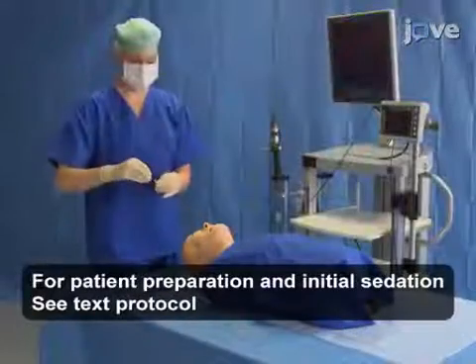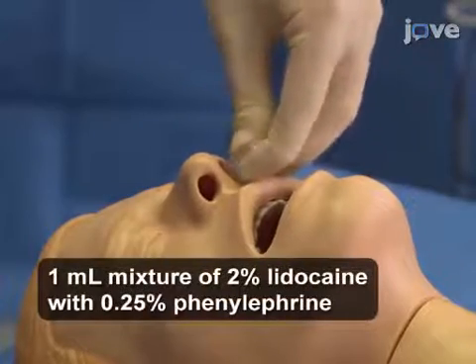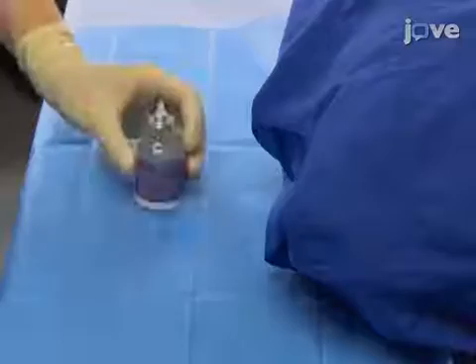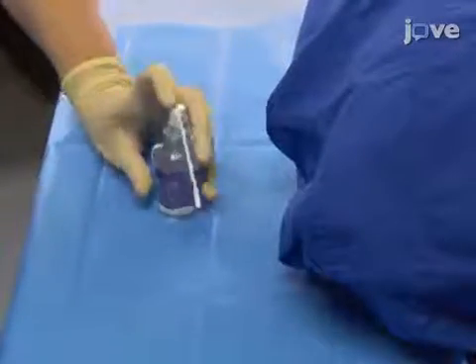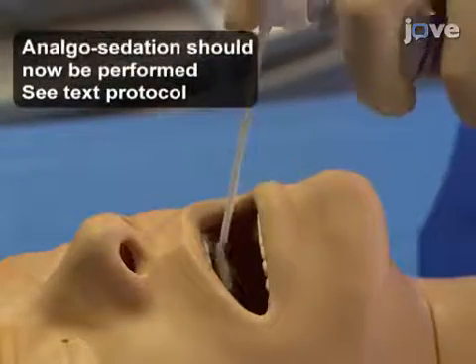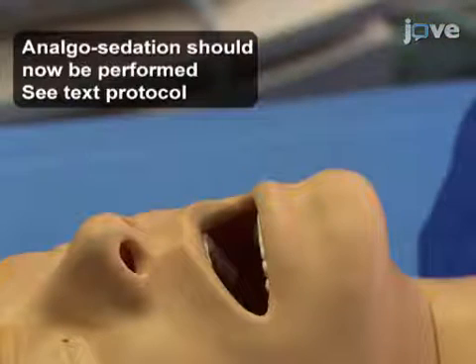To begin, apply a 1 mL mixture of 2% lidocaine with 0.25% phenylephrine to each nostril. Then apply a local anesthetic such as by spraying 10% lidocaine directly onto the mucosa of the oropharynx twice, from the tip to the back of the tongue. Ask the patient to gargle the lidocaine for as long as possible.